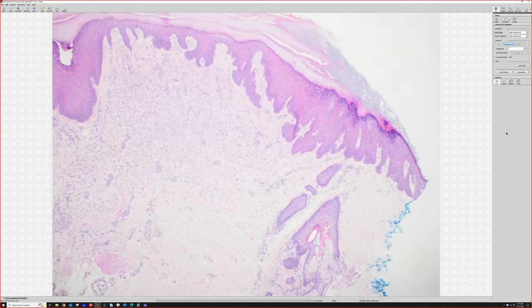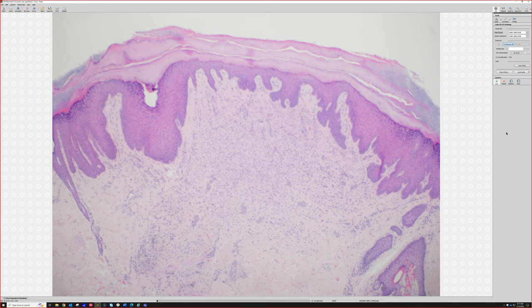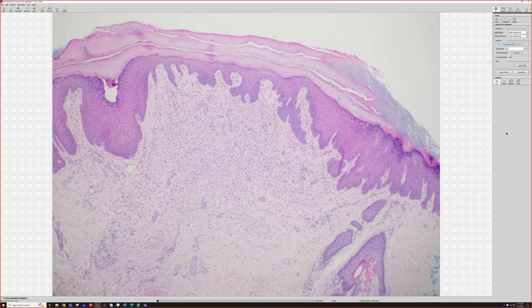But they tend to be right up in the papillary dermis, a nodule. Not every case, but they tend to be like this. They push up. They often get a little collarette around them. This one does not have a collarette, but they often have that. They sometimes have more circumscribed boundaries than this. And the cells are kind of plump and uniform with pale nuclei. And then if you do a stain, does anyone know what stain this will be positive for?